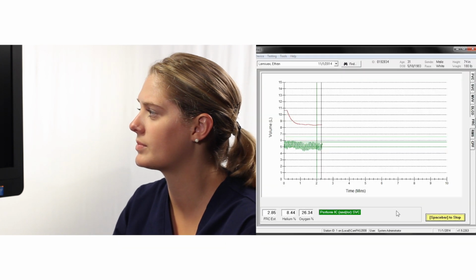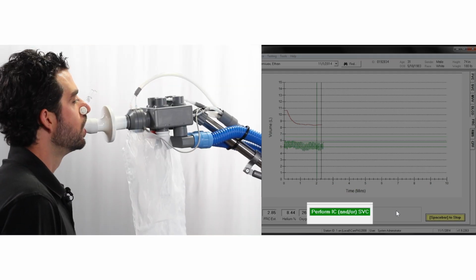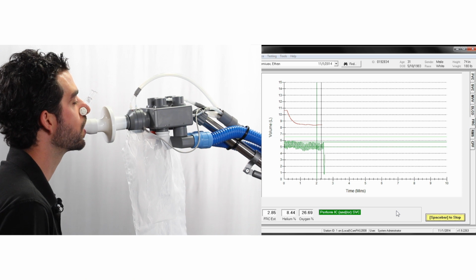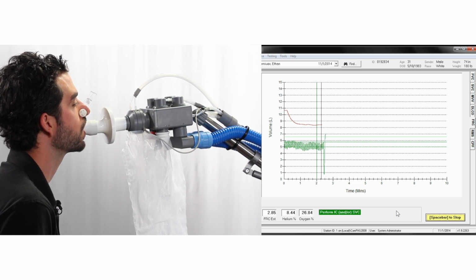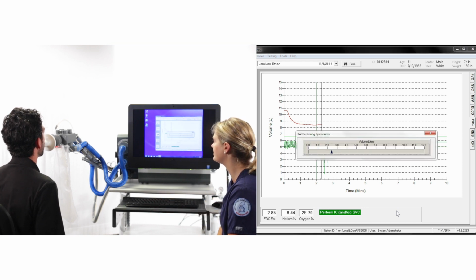Now, ask the patient to perform an SVC. Take a deep breath in as far as you can. Make sure that they are fully inflated. Then encourage them to breathe steadily out, slowly empty all the air out of your lungs, and squeeze every drop out until you are completely empty. Pressing space bar will end the test, and all results will be displayed.